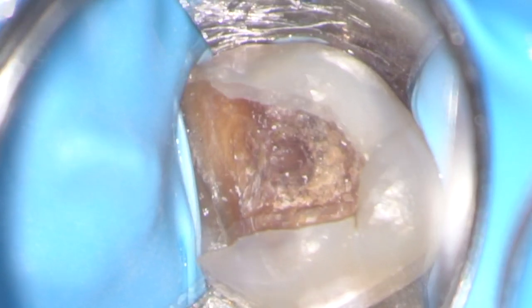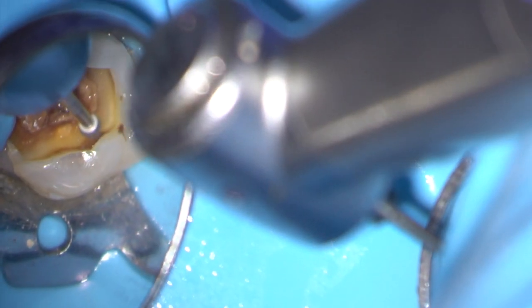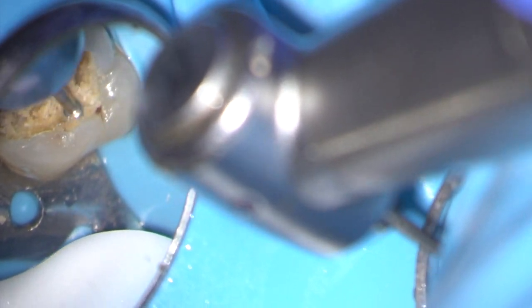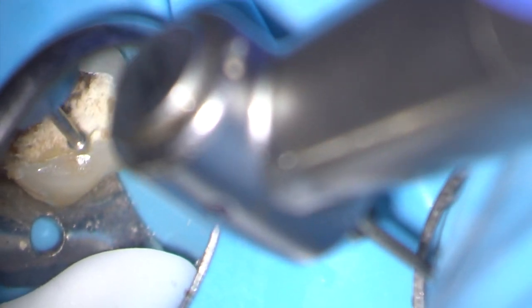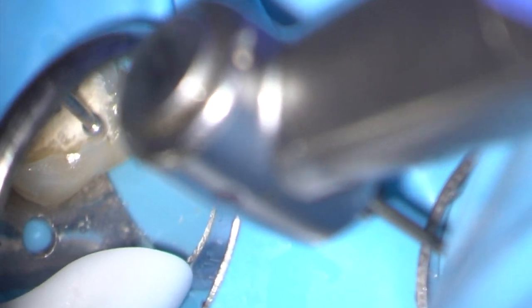I have removed the restoration and now we're looking at caries at the base of the access. I'm going to remove this using a large LN burr and then refine the cavity with a long tapered diamond.